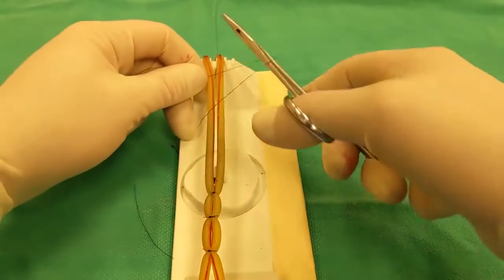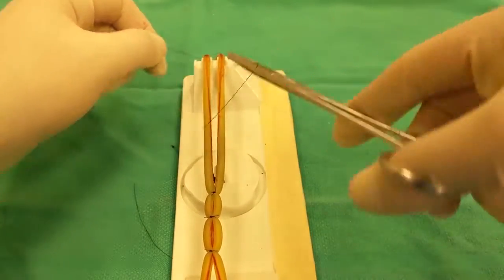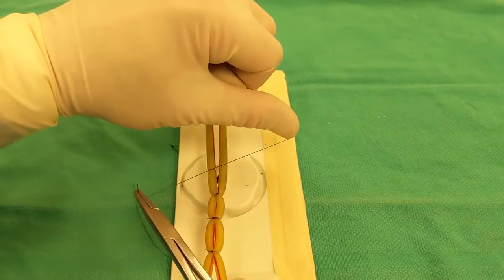You can see I'm chasing down my tag here. I'll show you later in the video how to do a little bit more controlled suture tag management while you're tying.